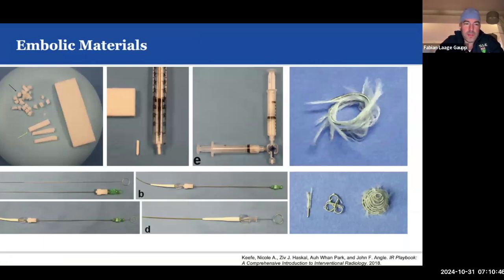We talked about different embolic materials here, starting with the most basic, gel foam, which is just a gelatin sponge, which you then cut into little pieces and mix up to produce a slurry. You can also make little torpedoes like they do here and use that. Some people do that, for instance, after liver biopsy. They just load up the guiding cannula with a little torpedo and push it in with a little saline. So that's even quicker than producing the slurry.